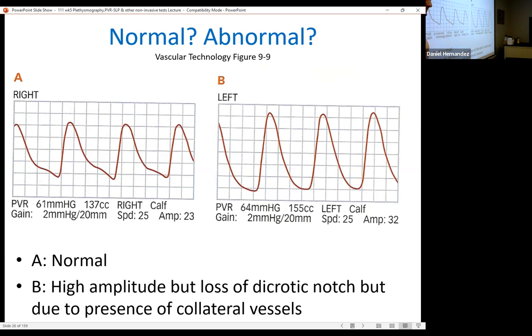Haven't you learned this by now, in the past 6 weeks? General ultrasound and OBGYN are a little different. With OBGYN, you're getting all the measurements for them and putting them in the report. With abdomen, you're getting a lot of measurements and describing things sonographically with general ultrasound, and then they go into a little more detail, because they have to diagnose off your findings.